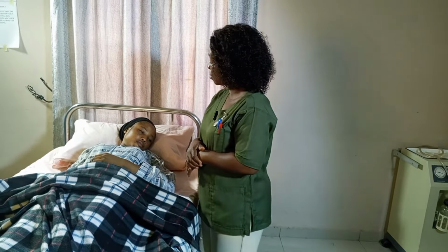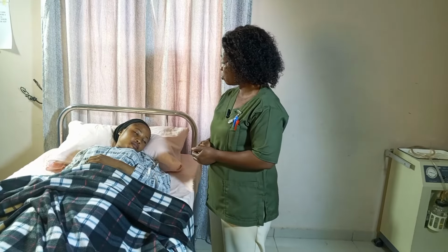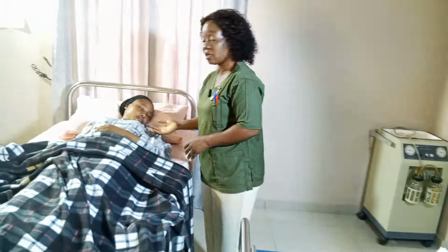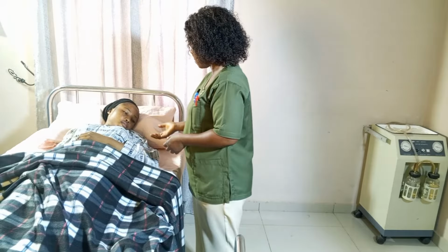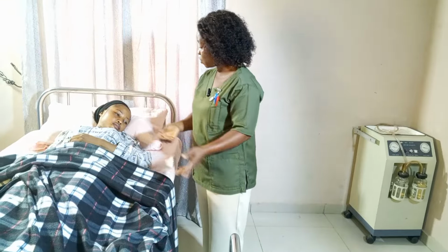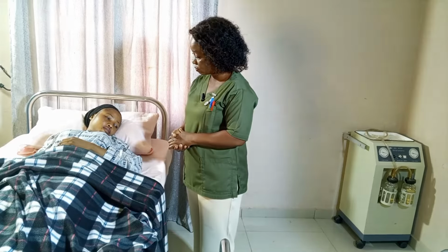So I am here to administer your insulin for you. Remember, your sugar level is high, and do not forget that whenever you're going to administer this kind of injection, most especially insulin, you have to check the patient's sugar level. Already I have checked my patient's sugar level and it is high, so I have to administer according to the prescription, right? Since I know that her sugar level is high, remember I checked your sugar level with the test I carried out a while ago, that is why I'm going to administer this insulin to you, right?